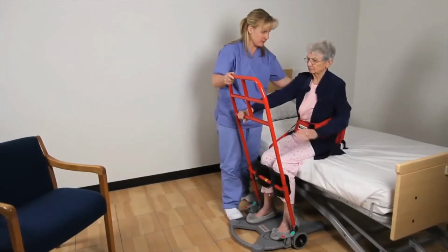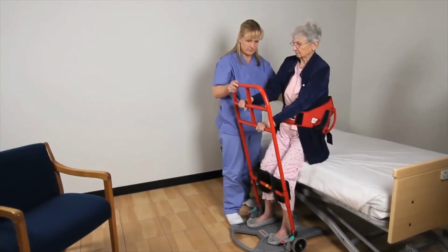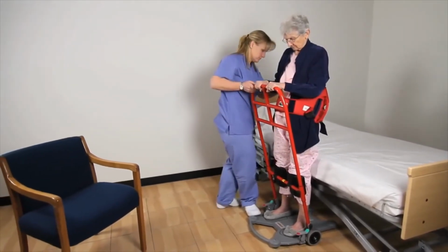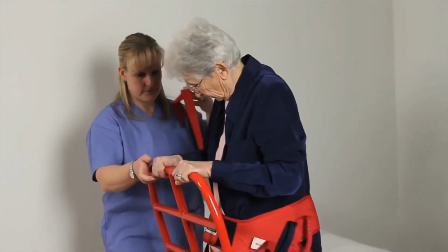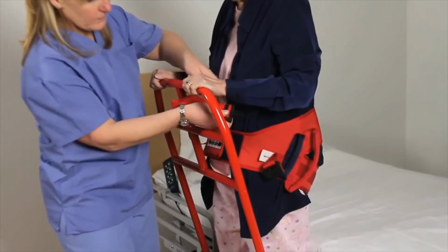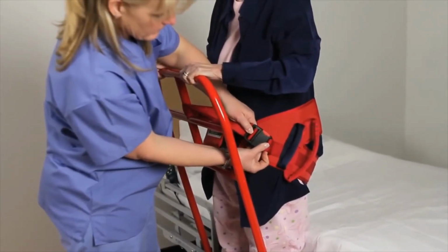If the patient is weak, the caregiver will stand to the side of the Return with one foot on the base and grasp the Return belt handle to assist the patient to a standing position. Connect the Return belt safety strap around the center vertical hand grip of the Return. Connect the buckle, and when you hear it click, test the buckle by pulling it to make sure that it is safely connected.